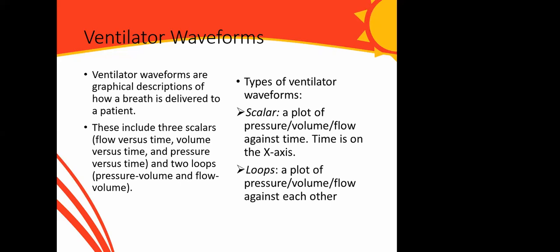because giving more pressure during the expiratory phase will cause more barotrauma, more atelectrauma, because at the end of expiration you really do not need positive pressure. But in order to improve oxygenation, what we're doing with COPD is to improve oxygenation and give more time for carbon dioxide to be blown off. And don't forget that the oxygenation we're talking about is not achieving a PO2 as high as normal, because at that point their respiratory drive is only responsive to hypoxemia.